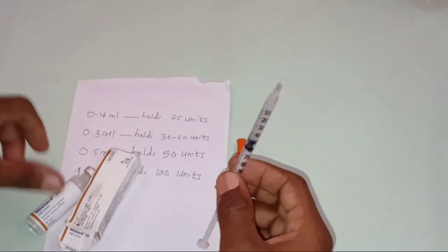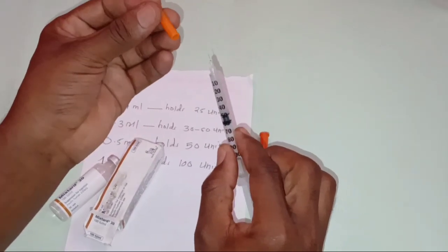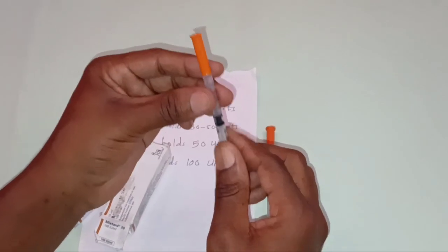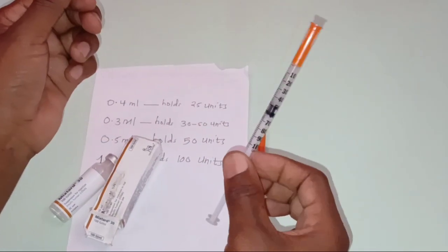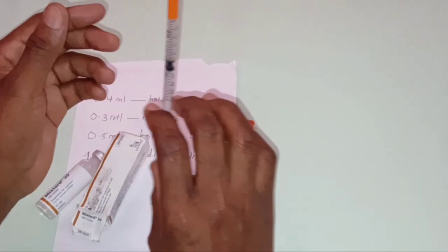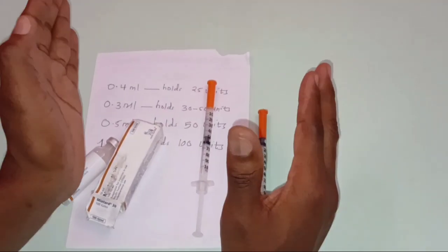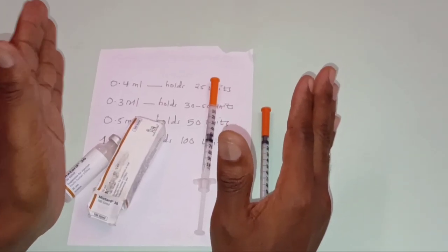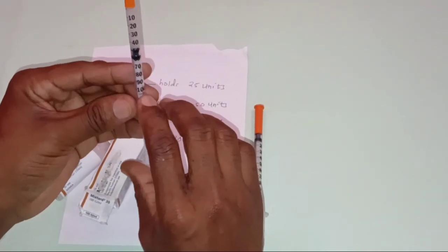Then make sure you avoid touching the needle, because it can cause contamination. Then you put back the cap of the needle to avoid contamination or mechanical damage to the needle. Then that's the time you can administer the drug to the patient. Whenever you're administering, ensure that you follow the 7 rights of drug administration. That is right patient, right drug, right dose, right route, right time, the right reason, and the right documentation. That is the time you can administer the drug to the patient.